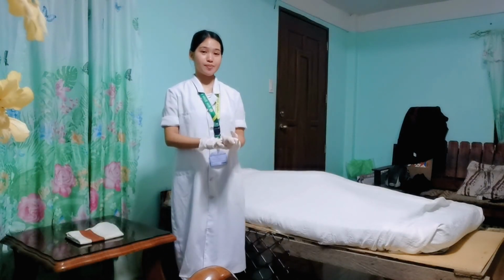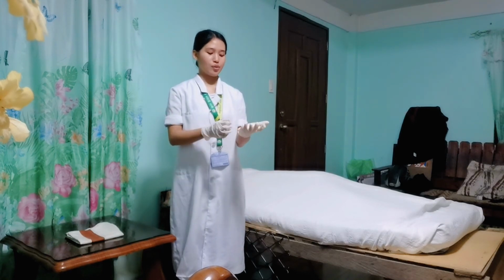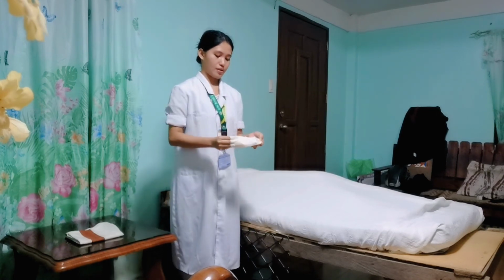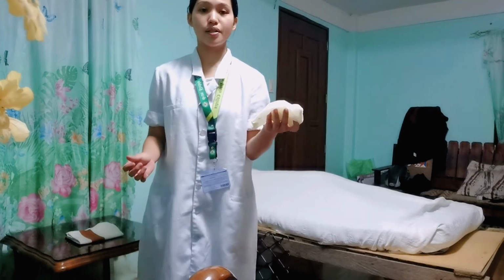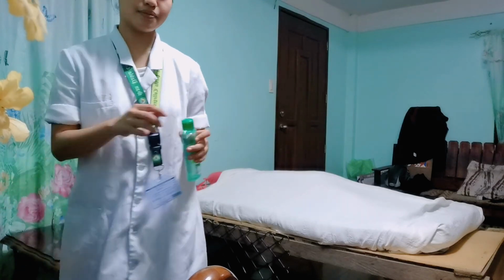And then after disposing the soiled pillowcase, we're going to remove our gloves. And afterwards, also dispose the soiled gloves and perform hand hygiene.